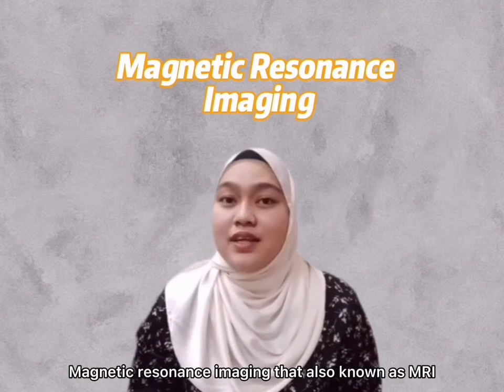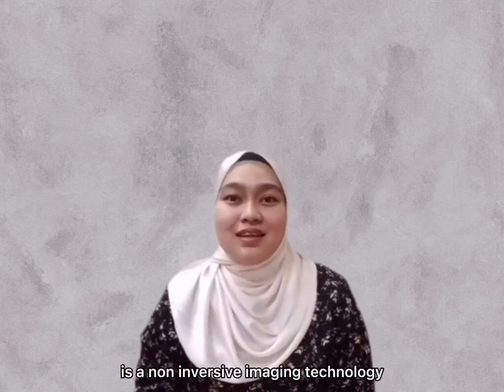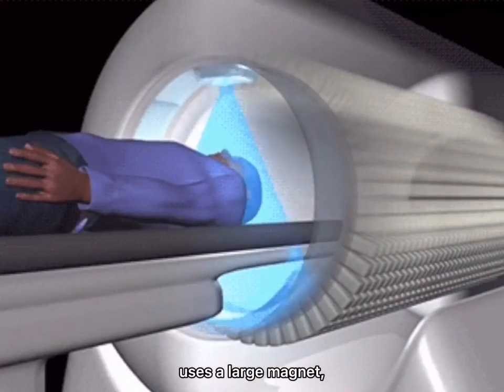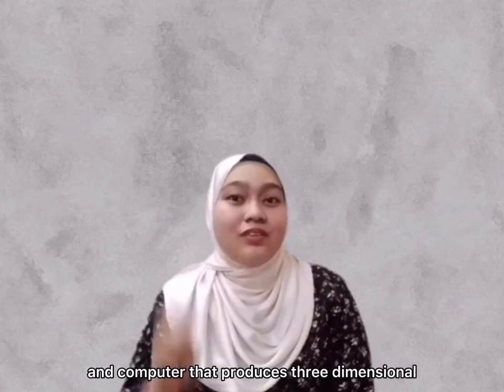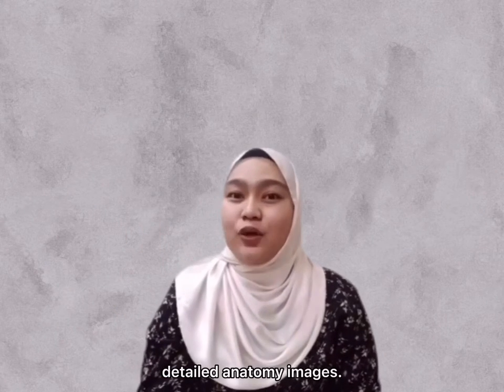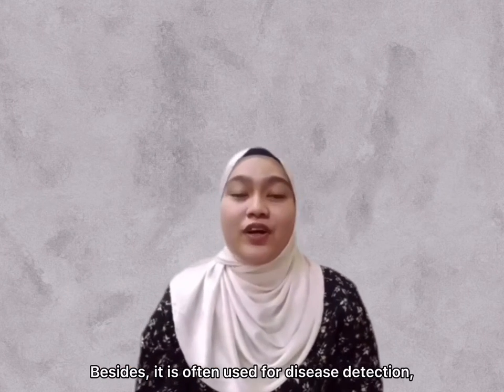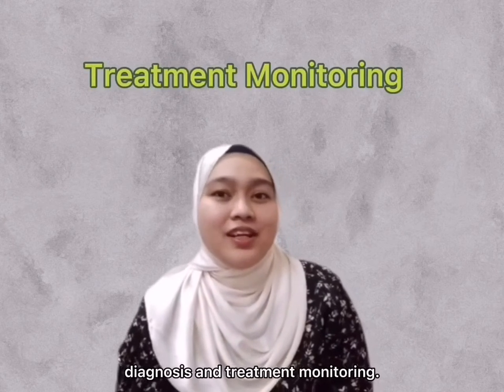Magnetic resonance imaging, also known as MRI, is a non-invasive imaging technology that uses a large magnet, radio waves, and a computer to produce three-dimensional detailed anatomy images. Besides, it is often used for disease detection, diagnosis, and treatment monitoring.